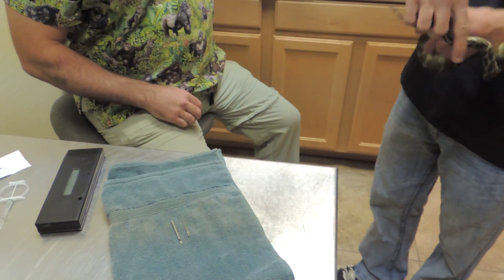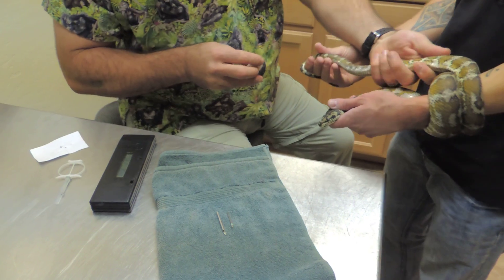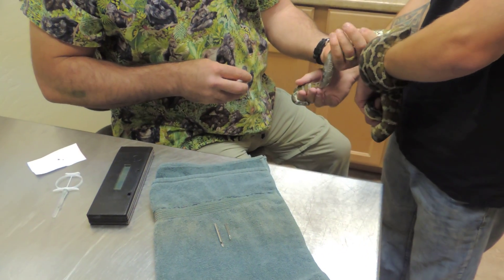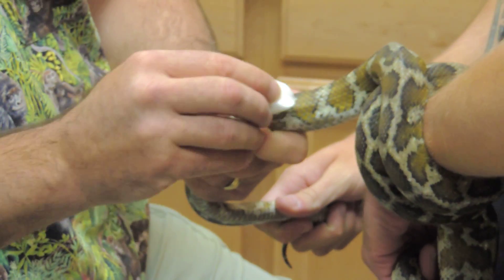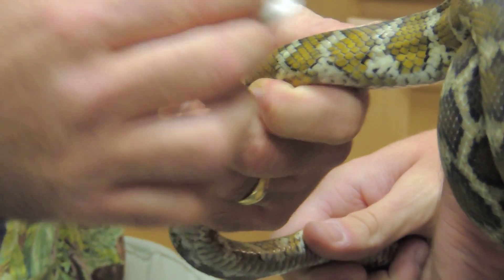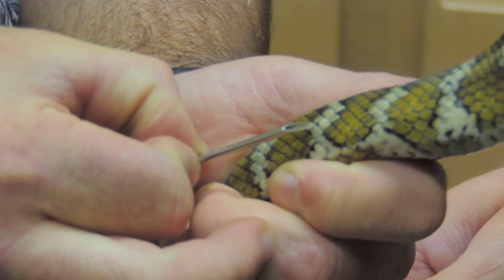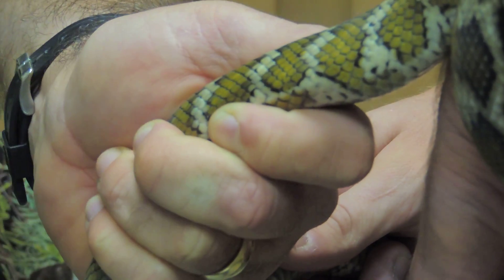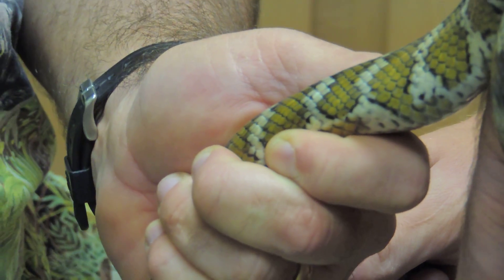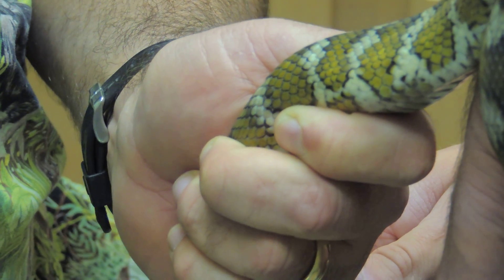So we go ahead and do our second patient here. The old needle would basically be this size going into this patient. The new needle is that size, which is a big difference.